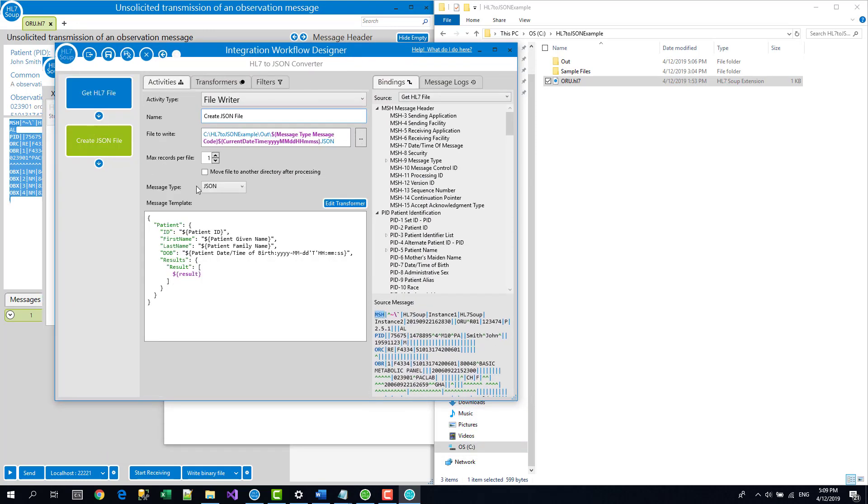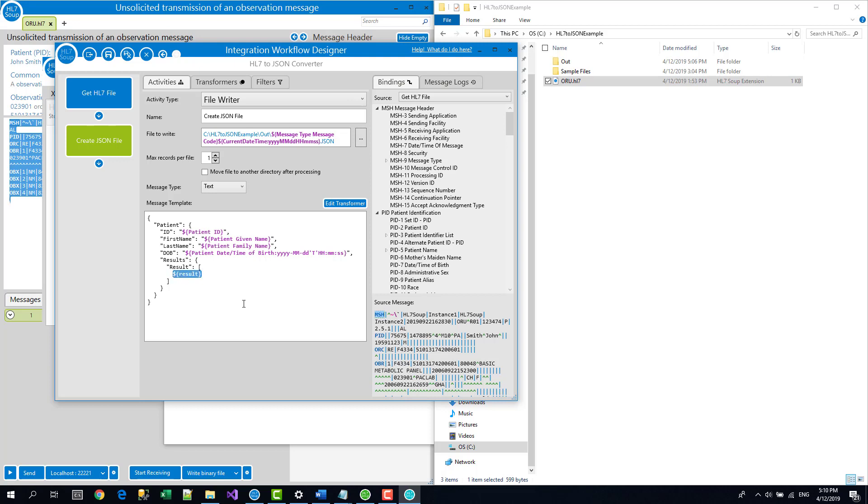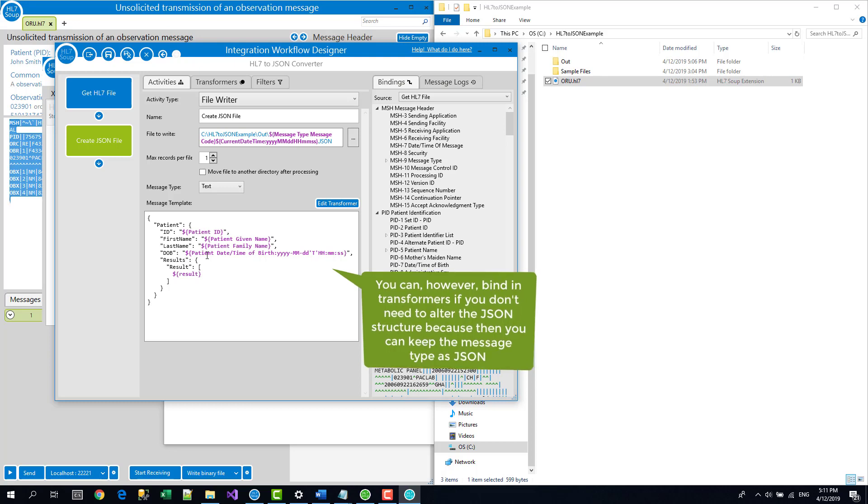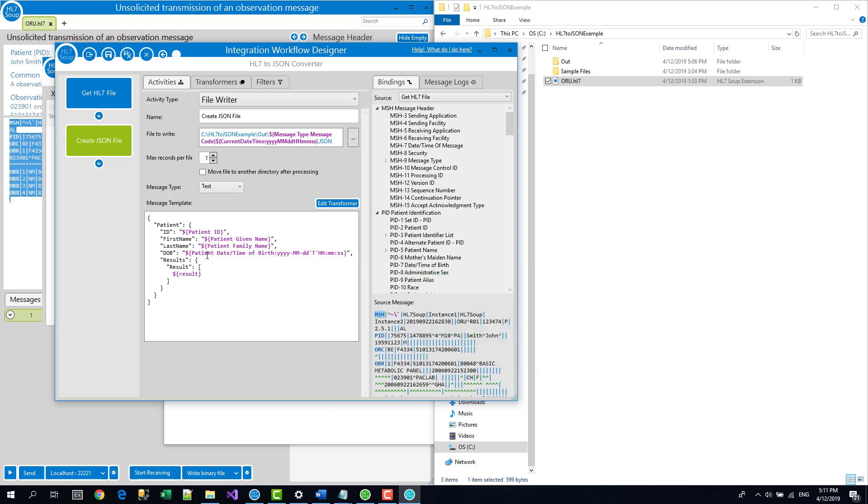Go to the second activity and change the message type from JSON to text. We lose all that nice coloring, but it's converted it now to a flat file. So it's no longer going to be parsed by the runtime engine, which means it doesn't mind the fact that it's got this random field sitting in the middle of the text. It didn't mind it incidentally for these other ones here because they're inside the quotes. So that's fine. It doesn't corrupt the JSON syntax, but this dollar sign here did. So that's why it's telling us to convert it to text. That's also why I said earlier, don't do the direct mappings in the transformers for HL7 to JSON because I knew I was going to have to convert that JSON message type to plain text, which you can't do the bindings between the message types because it doesn't understand those message types. Okay, so now I've got that correct. I'm going to save and close it again.